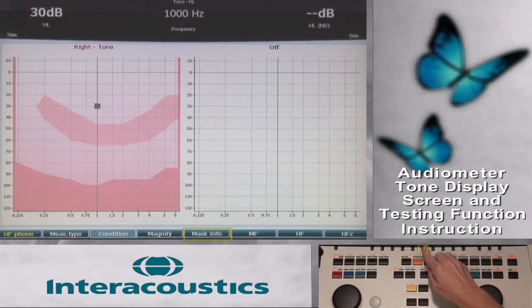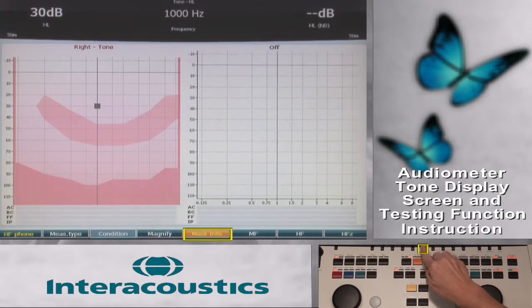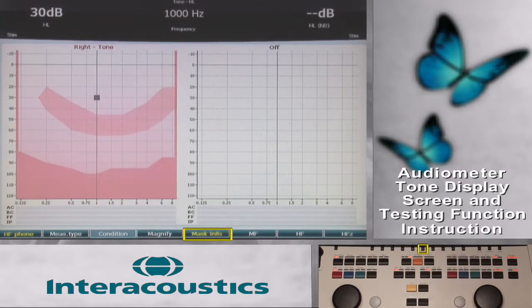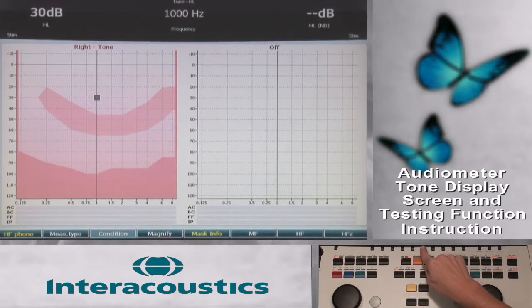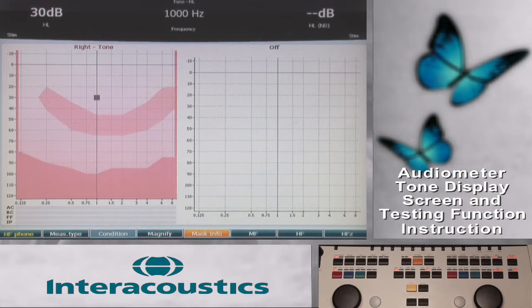The Mask Info function key will display the masking table below the audiogram to document masking intensity levels for headphones, bone conduction, free field, and insert phones. Dual audiogram display is required for the display of mask information.